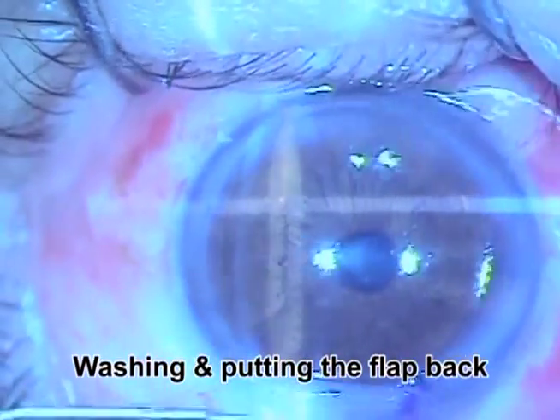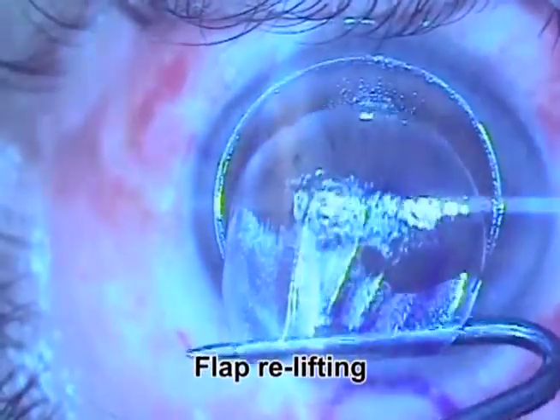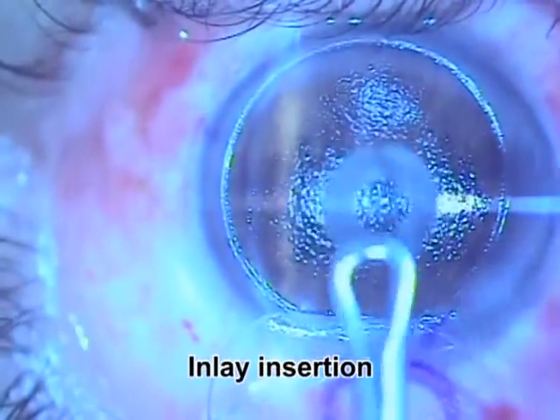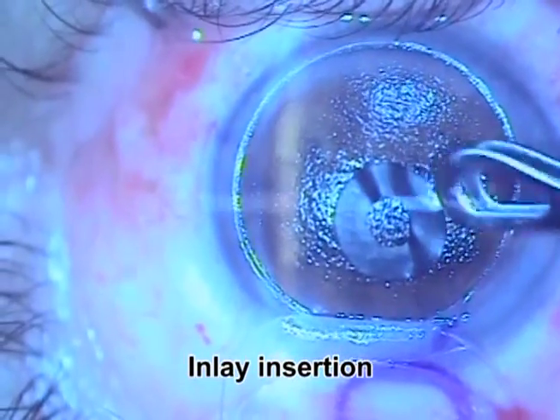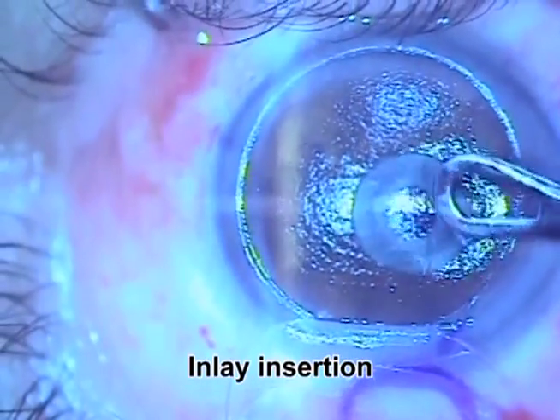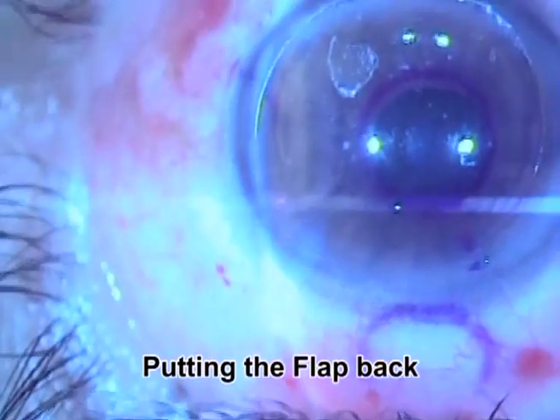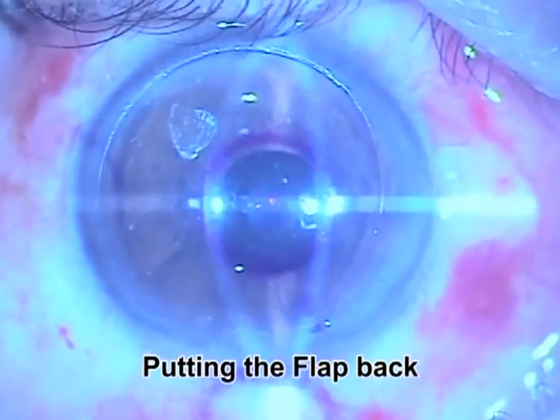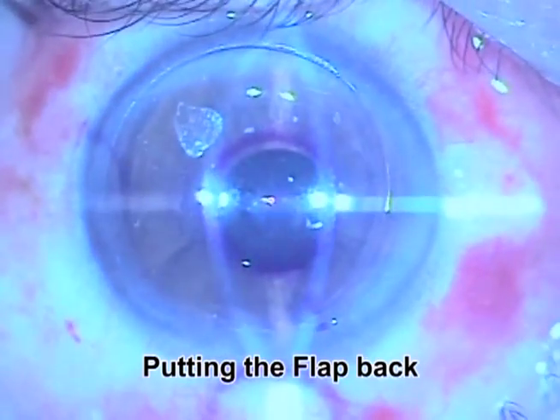You end the surgery by washing and putting the flap back. Then you re-lift the flap and insert the inlay under a relatively dry situation, trying to bring it as close as possible to the required centration. Then you bring the flap back and compare the position of the inlay with the AcuTarget map to see if you are close to perfection.